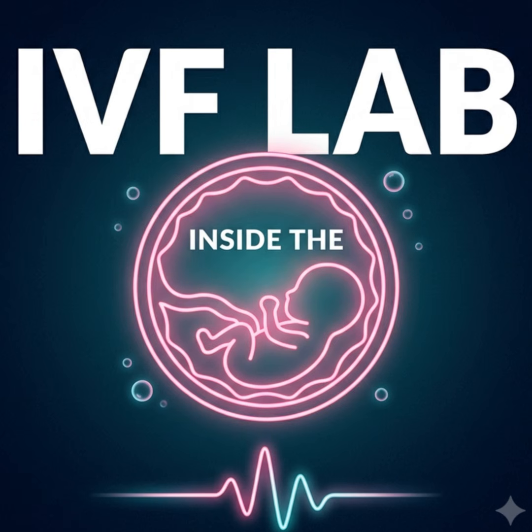I do want to clarify something for you listening, because this is an important distinction when understanding your own lab reports. In most clinics, time-lapse isn't completely throwing out the old morphological checklist, right? No, not at all. It isn't replacing the static assessment, it's adding to it. Exactly. The final morphology, how that blastocyst physically looks on day 5, remains incredibly predictive. Time-lapse doesn't replace the need to evaluate the inner cell mass or the trophectoderm. It simply adds the rich historical context of how the embryo actually built that structure.